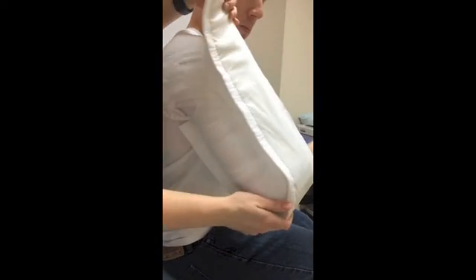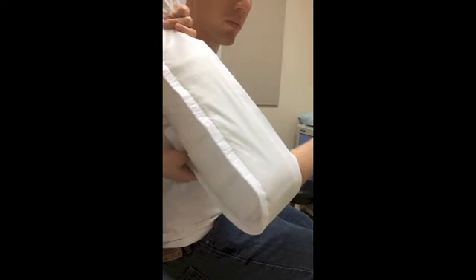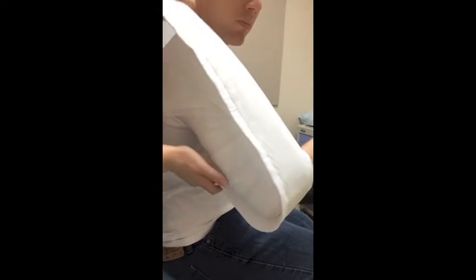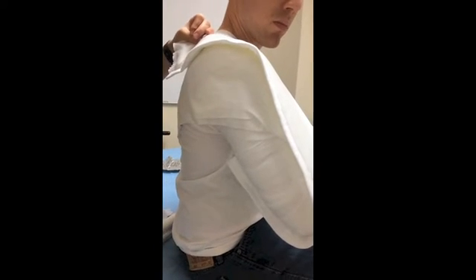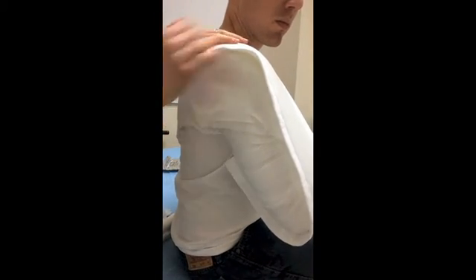We're going to tuck that nice and high into the armpit, come around and capture the elbow, still at that 90-degree angle. And then, sorry, I'm going to pull this down just a little bit actually. We're going to wrap this over the shoulder and onto the top of the scapula.